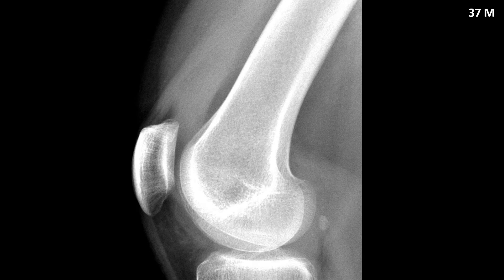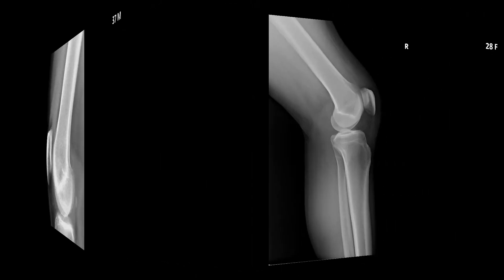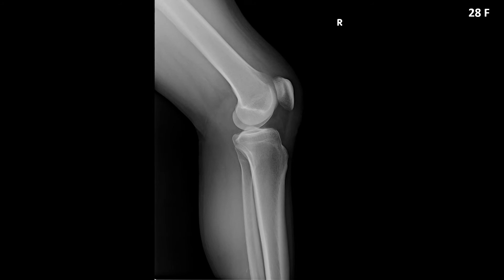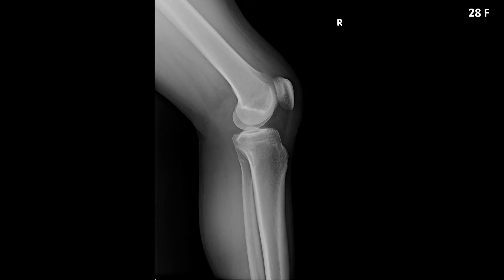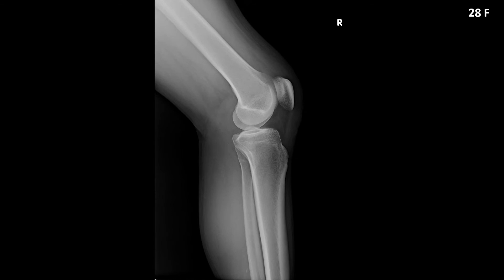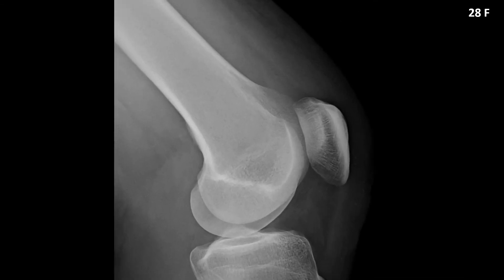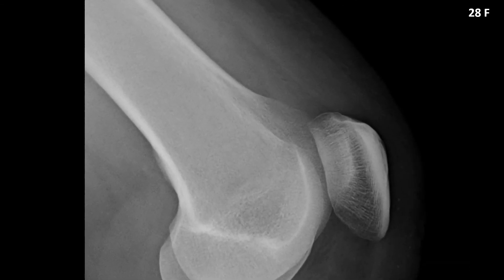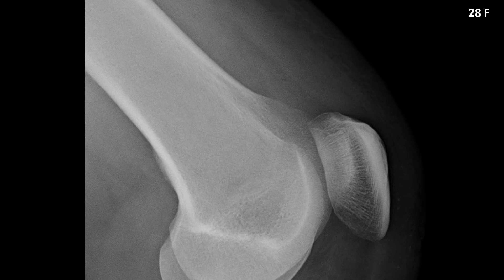This is a 28-year-old female who injured her knee playing basketball. If you look closely, you'll notice a difference between the supra- and infrapatellar joint regions. This slightly homogeneous appearance to the suprapatellar joint recess is indicative of an effusion.